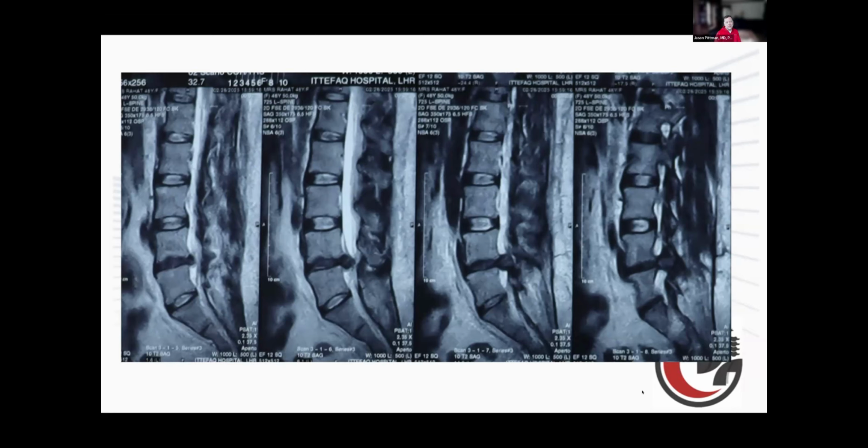And then the people that are really experienced with endoscopy argue in favor of hydrodissection of the scar bed, where you don't have to do sharp dissection with curettes or other instruments. You can really take advantage of blunt dissection with the water pressure to get through the previous surgical bed. So there are a lot of advantages of the MIS techniques for revision surgeries in this case.